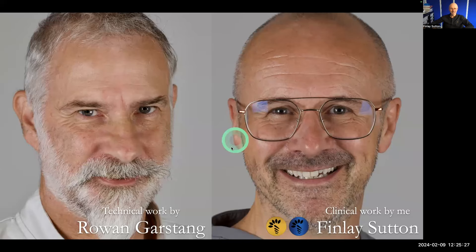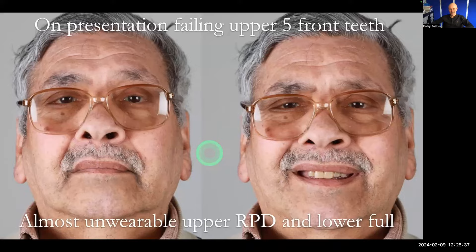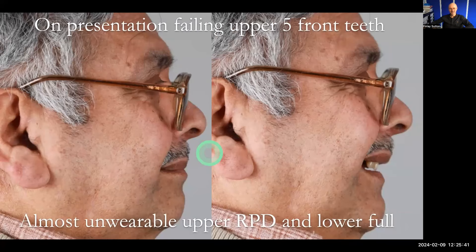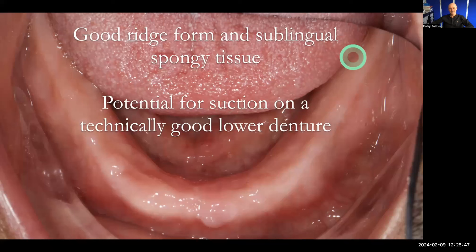All of the lab work is done by Rowan, my dental technician, and I do all the clinical work. Here is Rafiq at the beginning with these failing teeth and his remaining upper natural teeth. This is his lower arch — he's got no teeth at all in the lower, but really great ridges considering he'd had the extractions over 10 years ago. We had good potential suction primarily because of the big ridges, and also the sublingual spongy tissues were really good for helping with that suction effect.